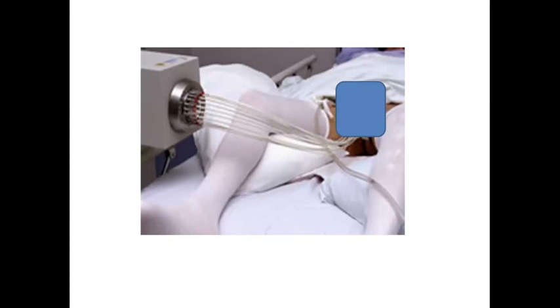And as I say, over the last 3 to 4 months, every patient has gone home the same day. The key side effects are that the area which we've punctured with 15 or 20 tubes is inevitably going to become a bit battered and bruised, and it can become quite dark and discoloured due to all the little punctures that we cause.